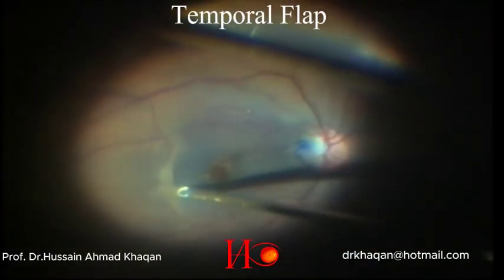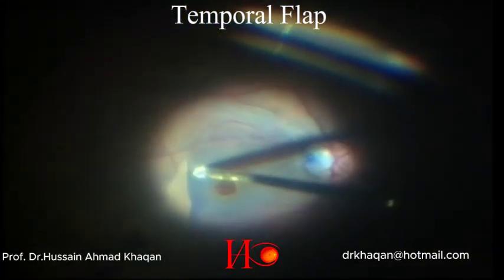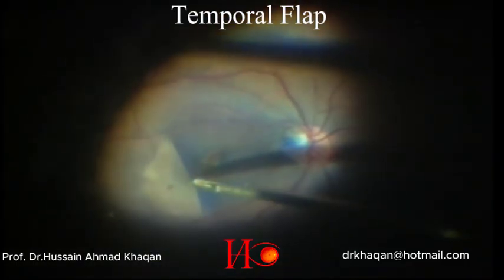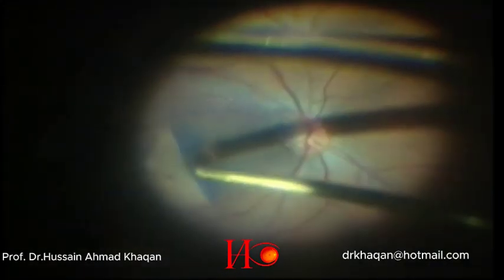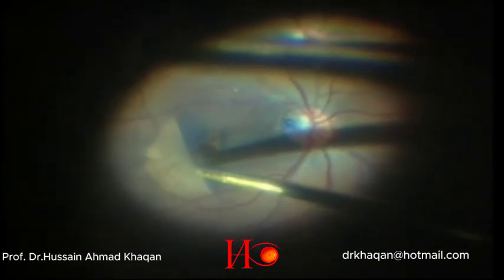Here I am fashioning the temporal flap. I am holding the temporal flap with the ILM forceps and just flattening it over the macular hole. Now I am injecting the viscoelastic gel just to iron the flap.